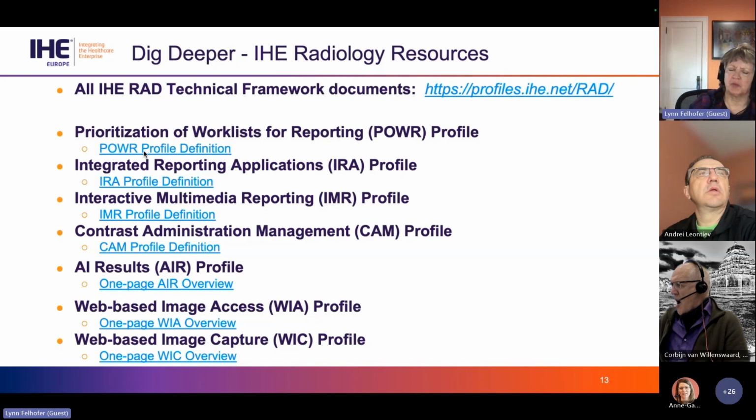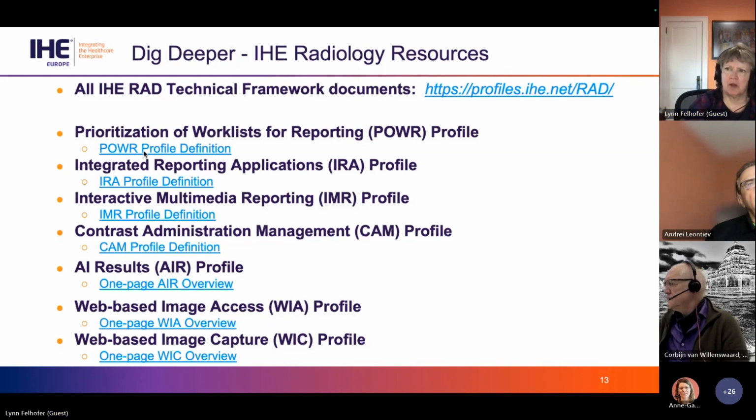Yep. So it's a FHIR implementation guide format, which includes the traditional IG content, including artifacts such as structure definitions, and those kinds of FHIR-based artifacts are now being published by IHE Radiology.